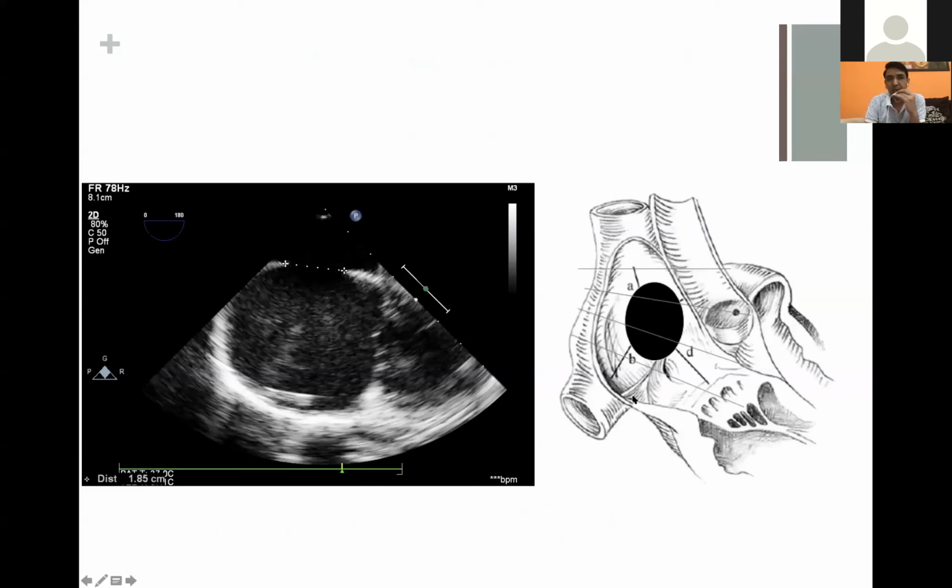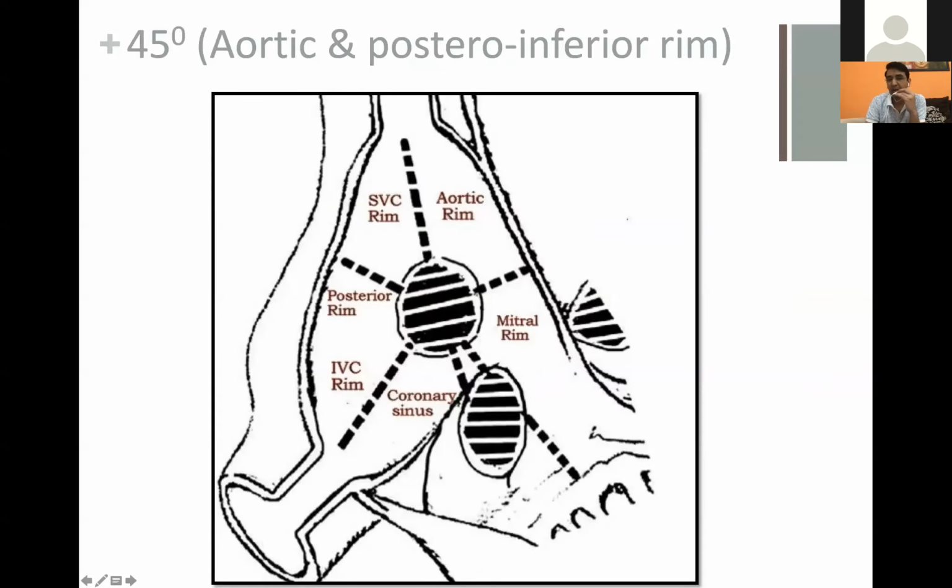These are the different areas where, if we look, we will realize the superior-inferior extent of the defect. Now, similarly, at 45 degrees, it is not a single line. It is multiple lines. Lines can be many more. Just for the representation's sake, I have taken only 5 lines to show you how 45 degrees will scan the area which is behind the aorta going up to the IVC.